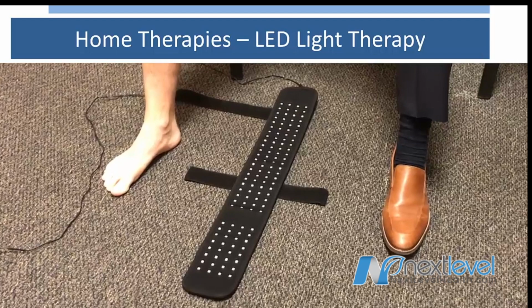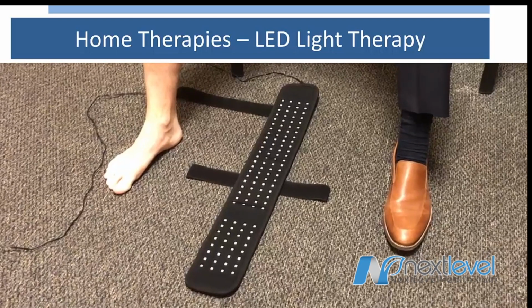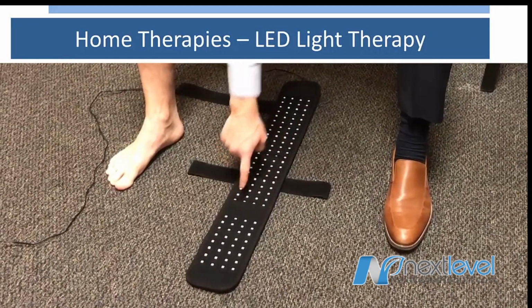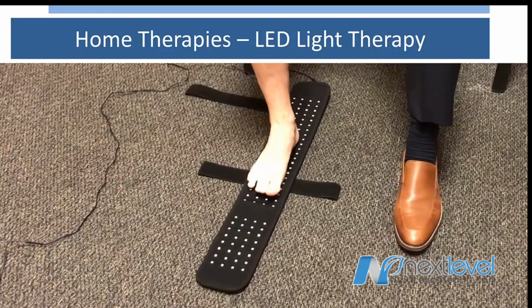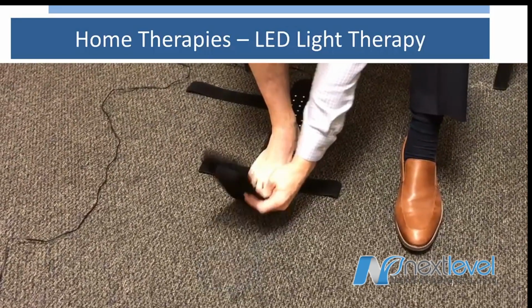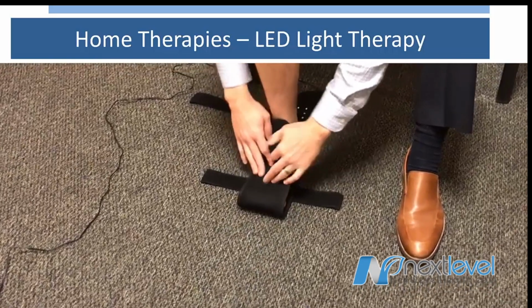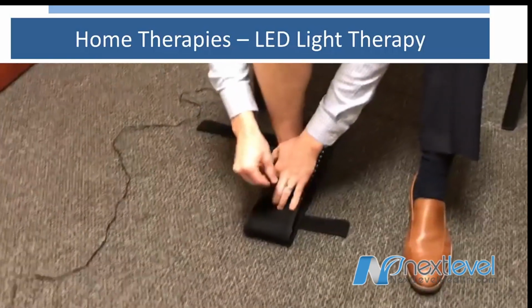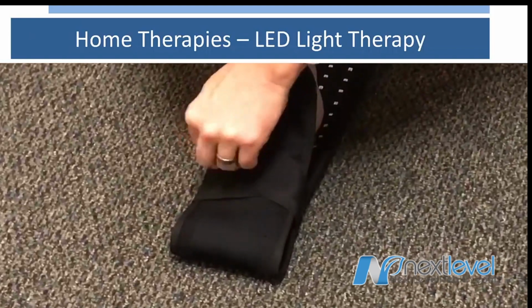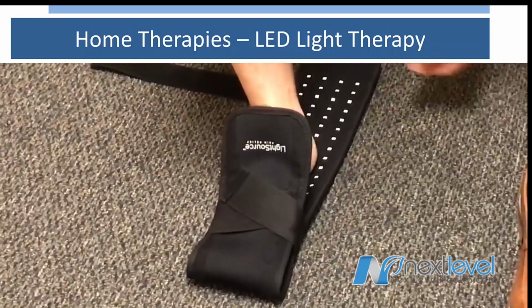Lay the light unit on the ground with the side that has the power button closest to you. Take one of the Velcro straps facing up and put it underneath the light unit as shown here. Place your foot in the light unit so it comes just up to the point where there's no lights. Fold the top piece over, Velcro it down on both sides, creating a little X, and that should secure the lights on top of your foot.